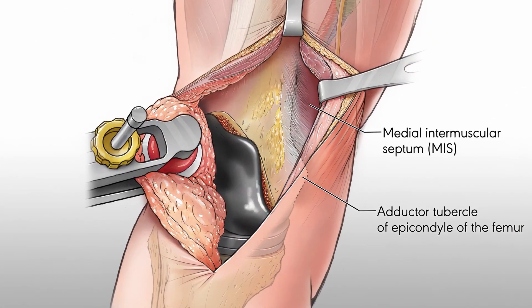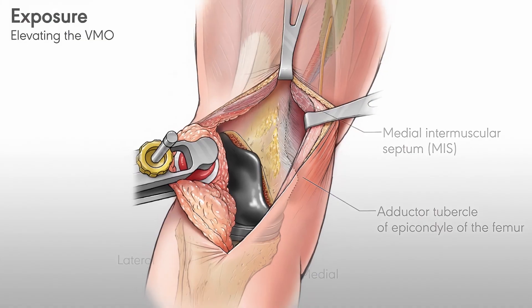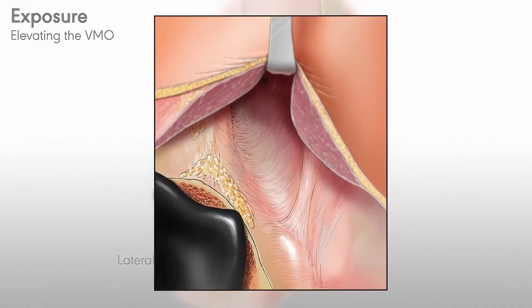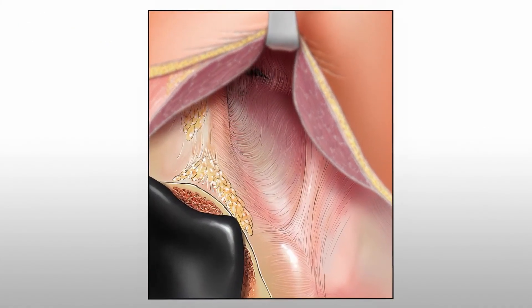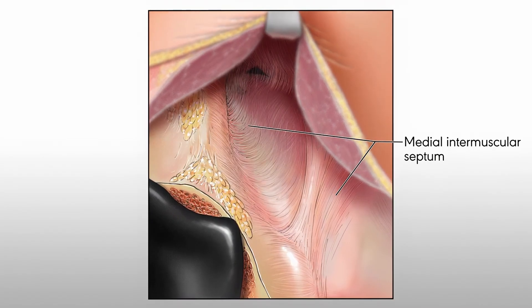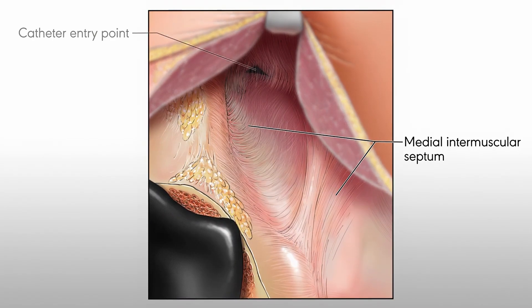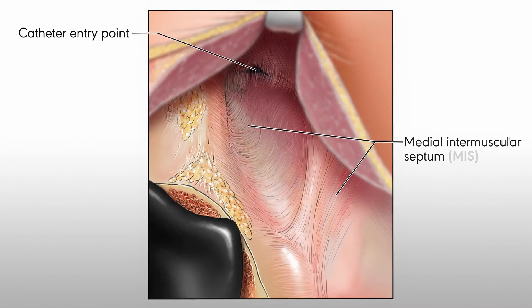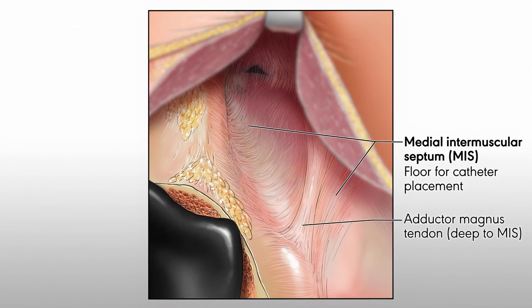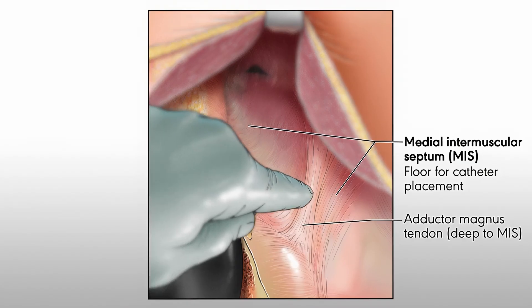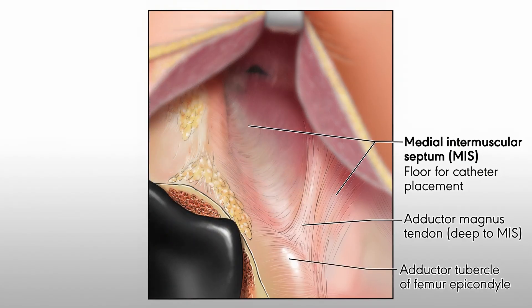Identify the adductor tubercle of the epicondyle of the femur. Retract the VMO with blunt retractors to expose both the anterior surface of the medial intermuscular septum and the catheter entry point. The medial intermuscular septum, which serves as the floor for the catheter placement, is readily visualized and lies just anterior to the adductor tendon. The adductor tendon can be palpated beneath the intermuscular septum as it inserts into the adductor tubercle.